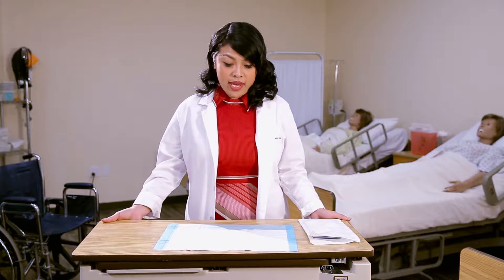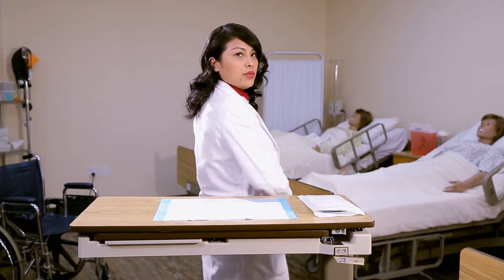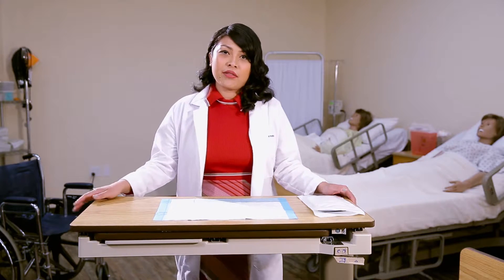Next, you want to make sure that your field is above waist, like so. You also want to make sure that you don't turn your back away from the sterile field. You always want to keep it in the line of vision.